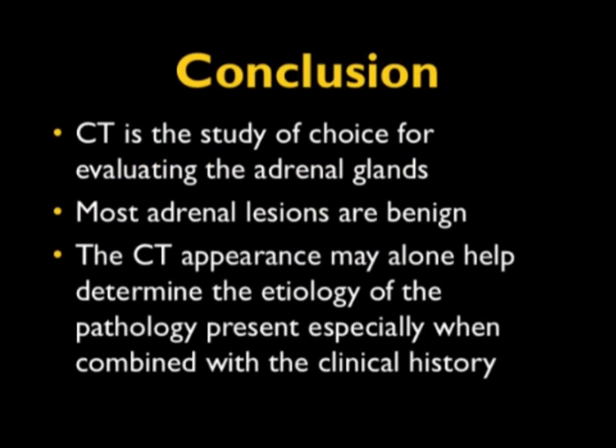So concluding then, the adrenals are a very important organ to us. Incidentalomas are classic and can be very problematic. We could be chasing through a long tunnel. But again, most of those lesions are going to be adenomas, very, very common. Again, if a patient has a history of malignancy, hypertension, or something else, then when you see an adrenal lesion incidentally, it's probably not incidental. It's maybe the cause of the patient's symptoms.